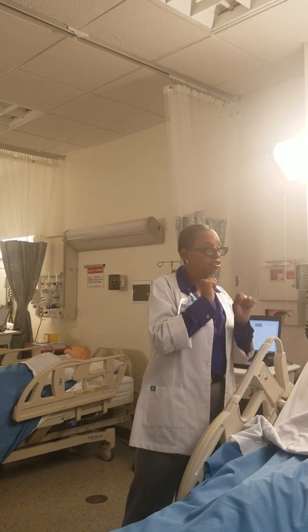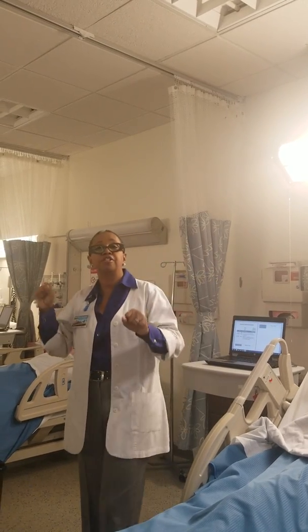If the doctor says, you think he's septic and I want to get a central venous pressure, I can hook it up only to that blue port only and give me my central venous pressure. Okay, if that makes sense. So yeah, they have different color codes and things like that.